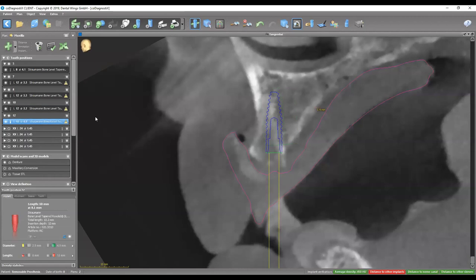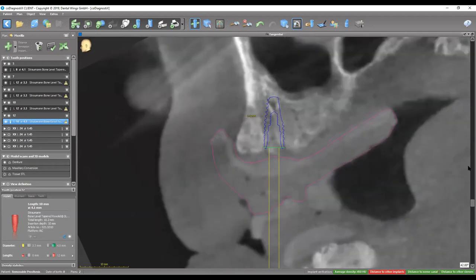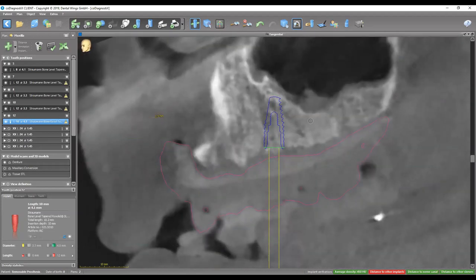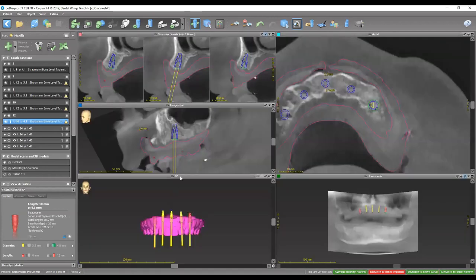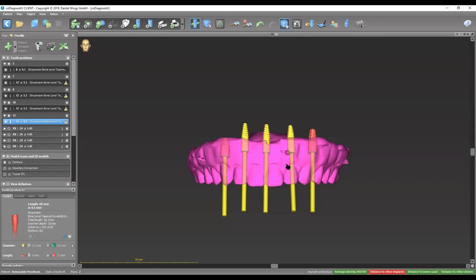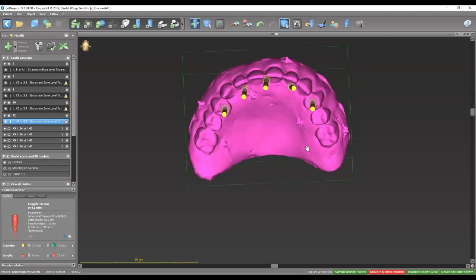And finally, number 12 — the distal implant on the left side. It's a 4.1 by 10. The vertical height here is a lot better than the other side, and the implant is placed in a better position. It's still going to be engaging the floor of the sinus, which is not going to be a problem as long as you're not encroaching on the sinus membrane. In the end, we have five implants with good AP spread and good distribution, which is more than enough to retain an overdenture on top.